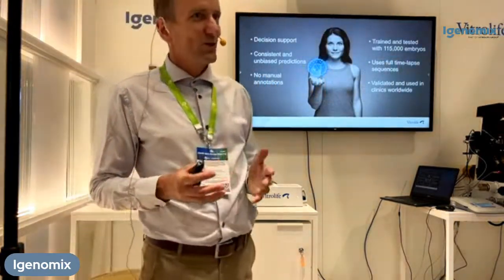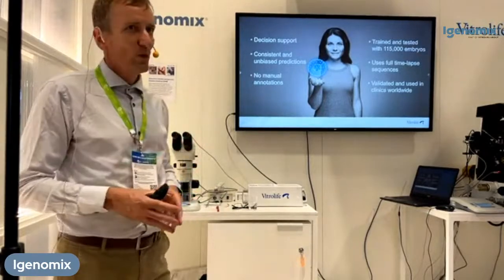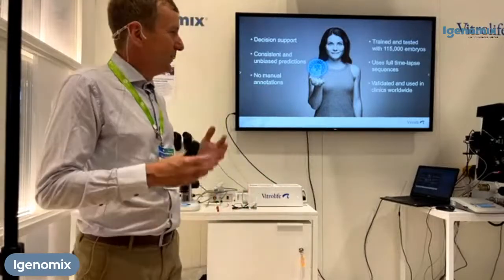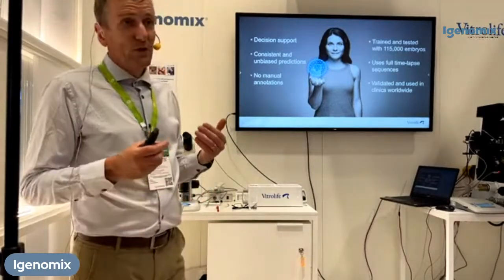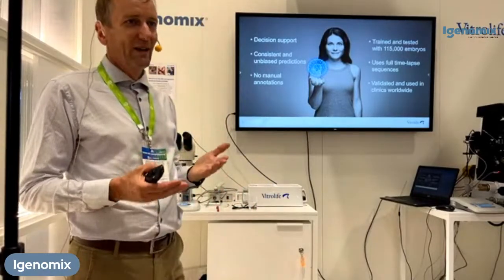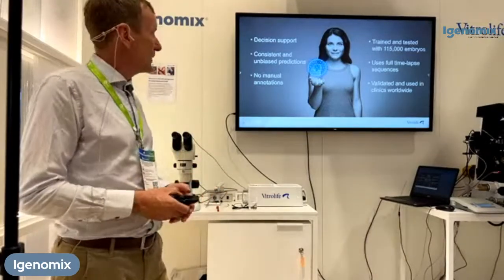So just to sum up, iDAScore is intended to be a decision support tool. It's still the embryologist that has the final call. It's not meant to be fully automated without anybody looking at each embryo. It gives you a fast and instant evaluation, and it's very consistent. It isn't biased with regards to different subgroups.